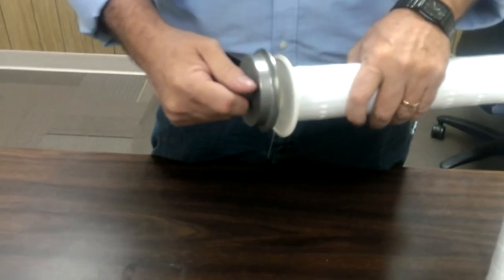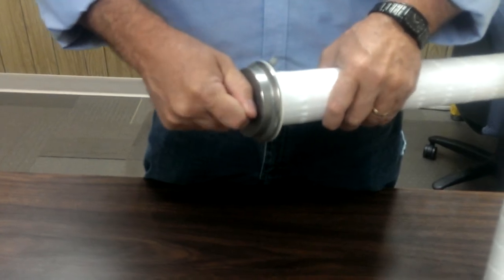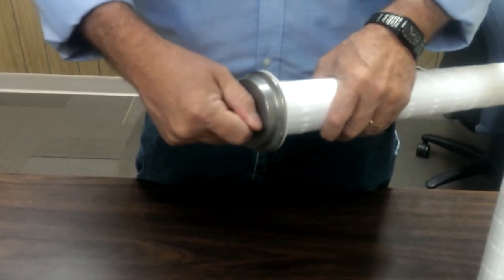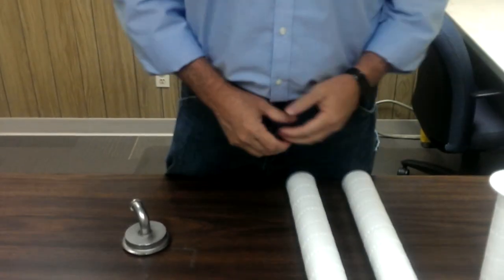So if you have a good one, the cap will just sit in there and it will be flush and you won't be able to rock it back and forth. That is the whole process for inspecting these filters. Thank you, have a nice day.